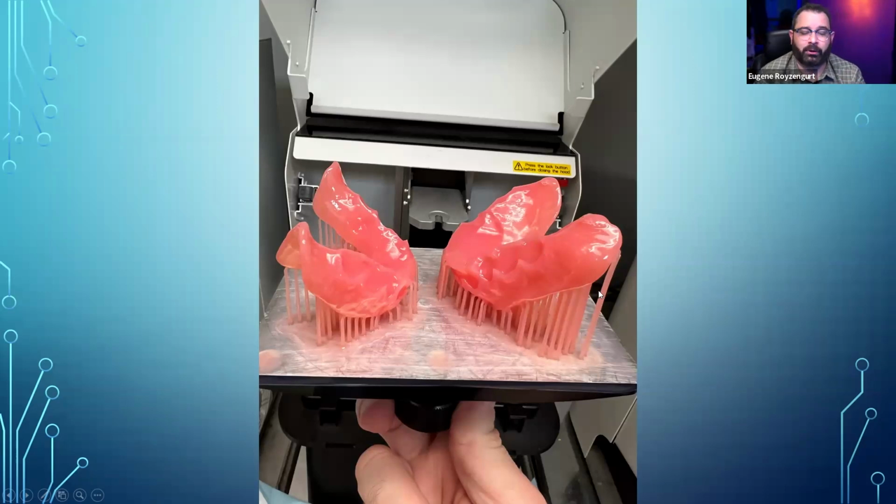Another thing to remember, the closer you are to the build platform, the more forces you're going to be placing onto those areas. So if, let's say we had a posterior palatal seal on our maxilla, and I place that towards the build platform, that area is going to be the most distorted, okay? And if you're trying to adapt it intraorally, that's not going to work really well.